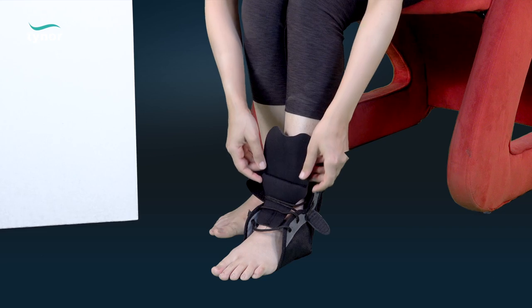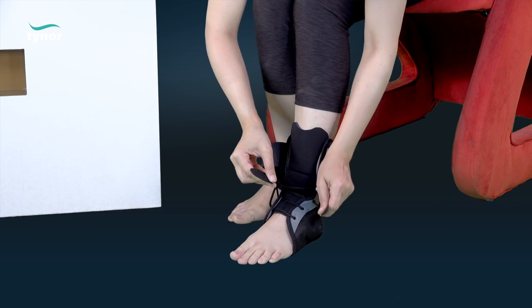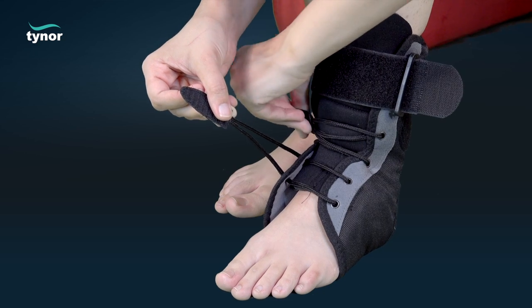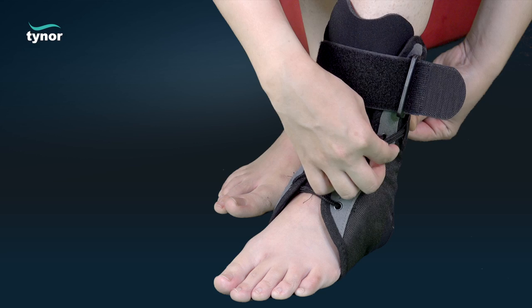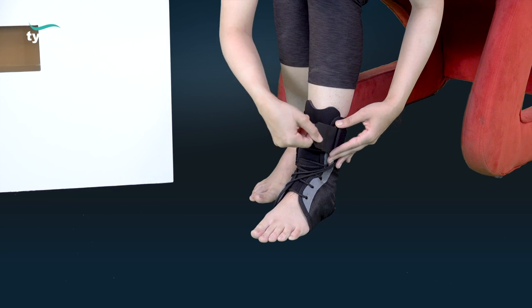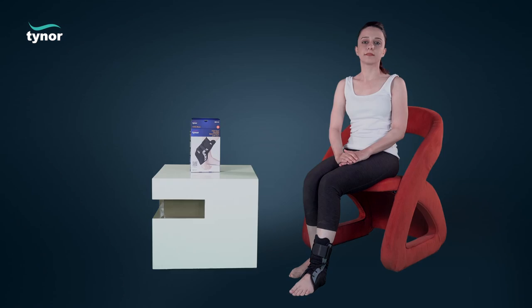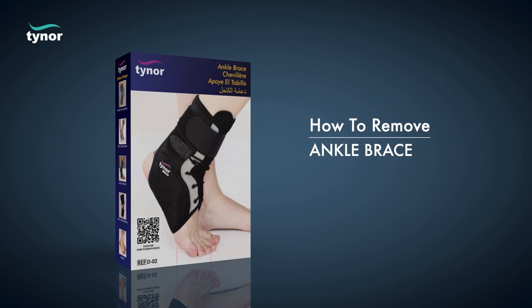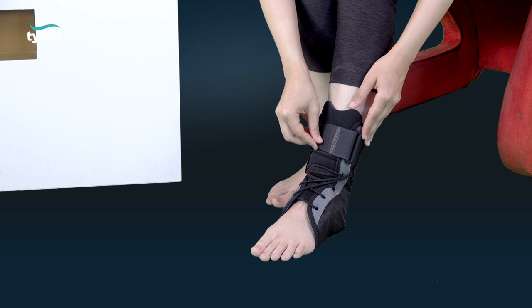Adjust the position of the lateral splints and tighten the laces from bottom upward to an optimal tightness in a figure-of-eight manner. Now fasten the strap from the medial to the lateral side.